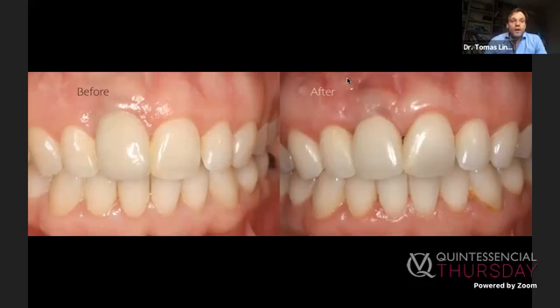these were something magical, before and after cases. Like you have a bad situation here, like a long implant crown, and suddenly by some magic, you have a shorter crown. And sometimes I even remember lecturers saying that we didn't graft anything, we didn't change anything, it was done just prosthodontically.